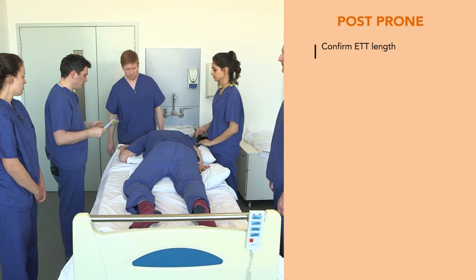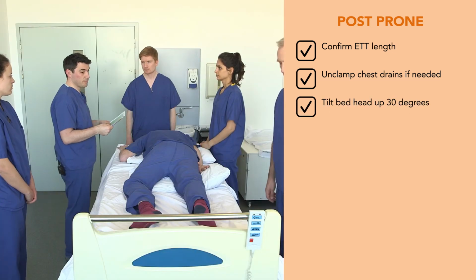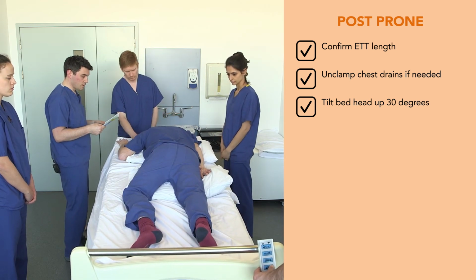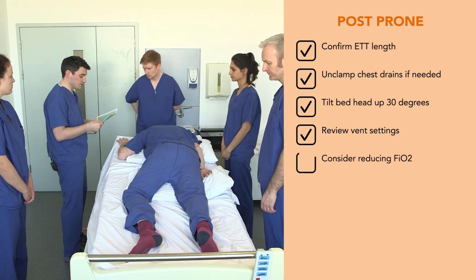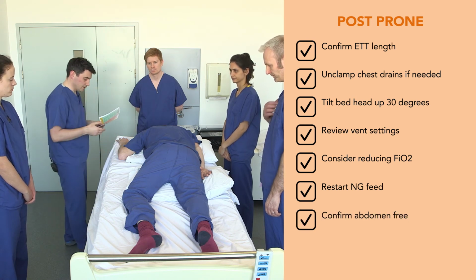So we need to confirm the ET length. If there are any chest drains, we'll unclamp them. We now need to tilt the head of the bed up 30 degrees. Thank you. We need to review the patient's ventilator setting and consider reducing FiO2. We need to start the NG feed, and we've confirmed that the patient's abdomen is clear.